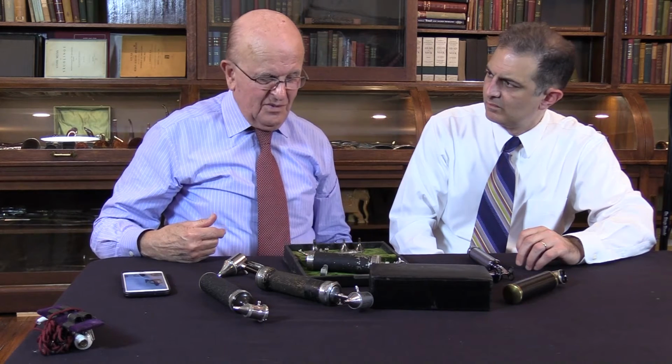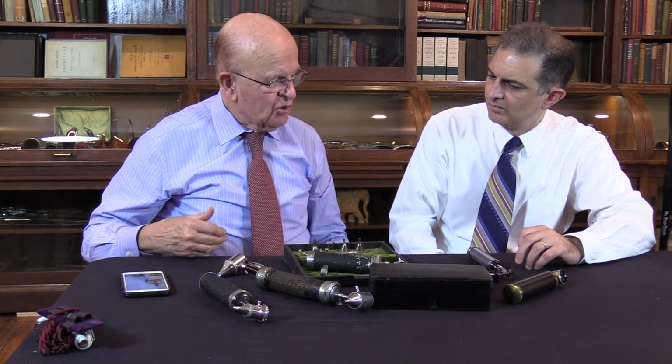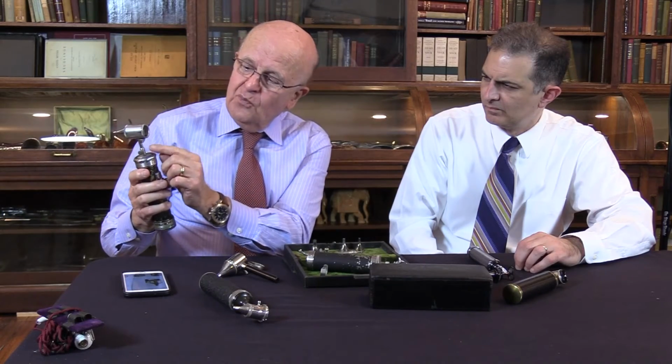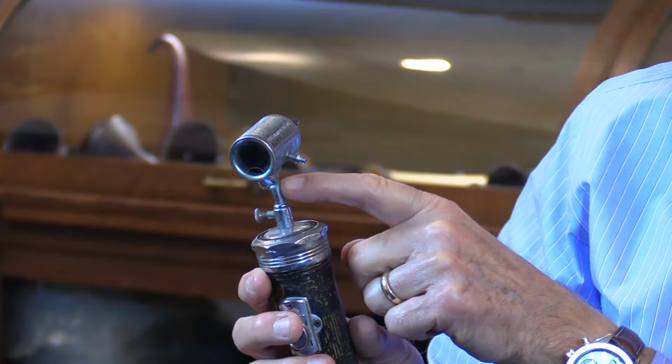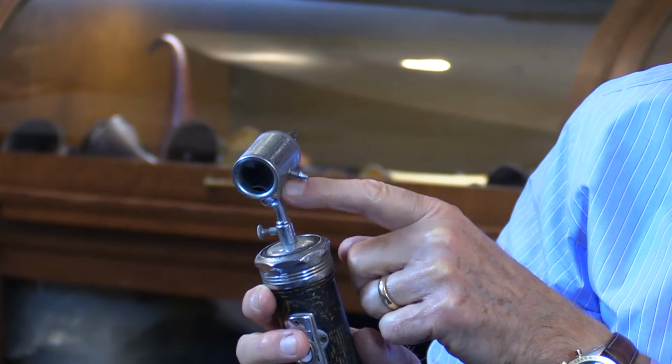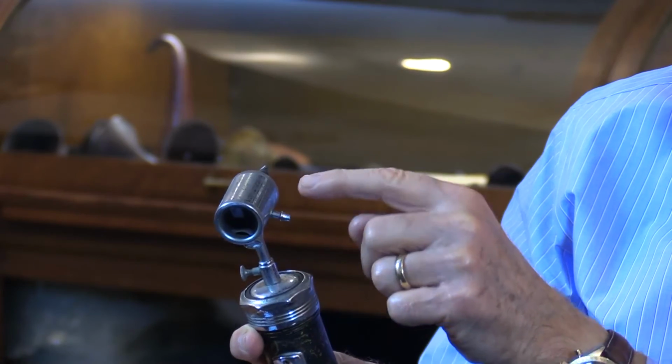The next step, the otologist wanted to be able to magnify the eardrum, but also to operate, to remove a foreign body, to do a myringotomy, whatever they needed to do at that time. So the earliest versions of these are the otoscopes with the lens and a little opening here where you can introduce your instrument. Again, you can see here where the light source is, the angle, as I always keep referring to it, is not the right angle as far as illumination of the eardrum.